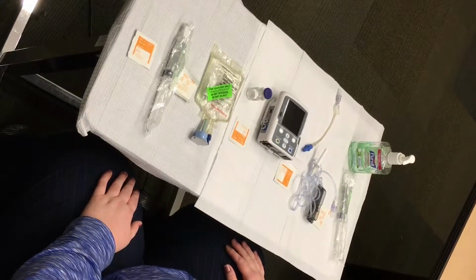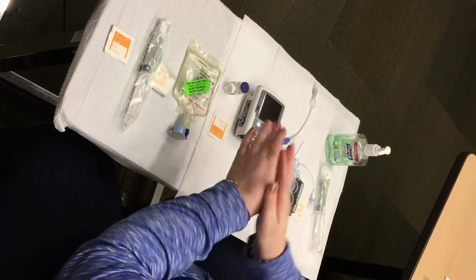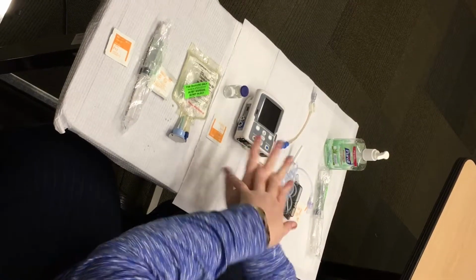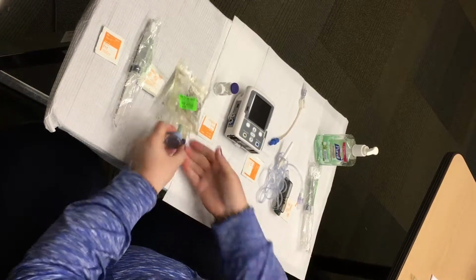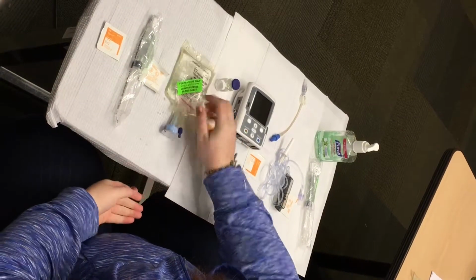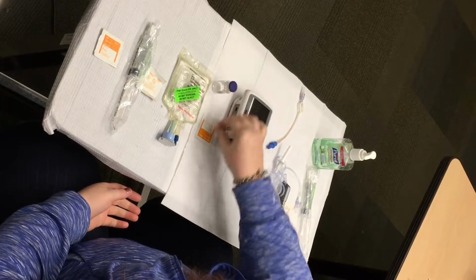First, you'll need to wash your hands and prepare your workspace. Line it with paper towels. Gather your supplies, including the mini bag, which contains the diluent in which the medication will be dissolved, the glass vial that contains the medication, and the alcohol pad.